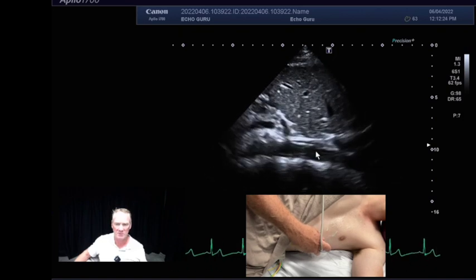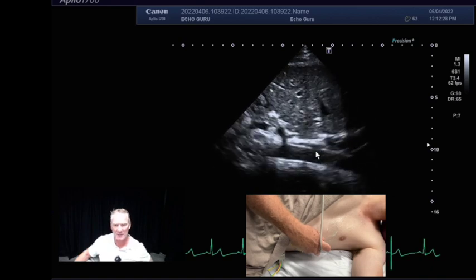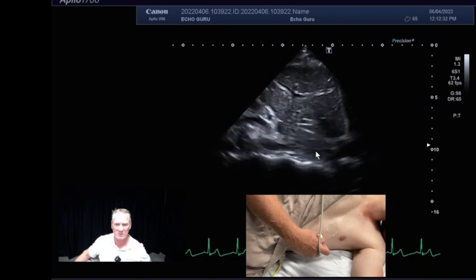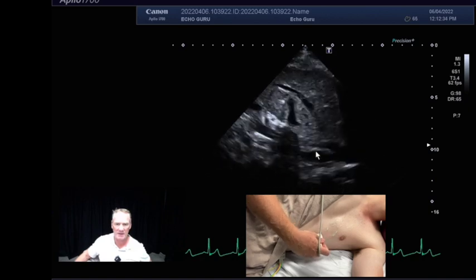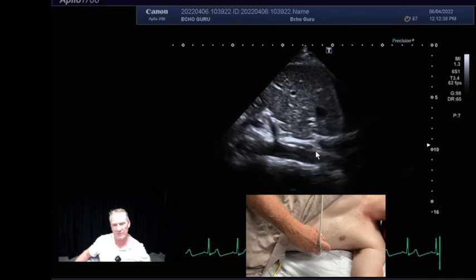It can be a bit tricky sometimes, especially in young people. It can easily confuse the IVC and the aorta. So it's always worthwhile making sure that you image the two to be able to differentiate that, yep, that's IVC, and that this is the abdominal aorta.